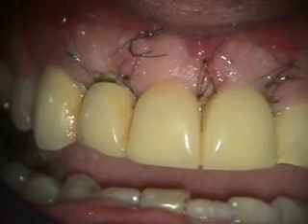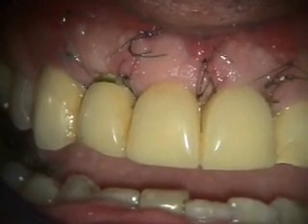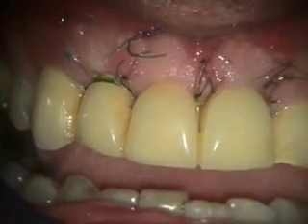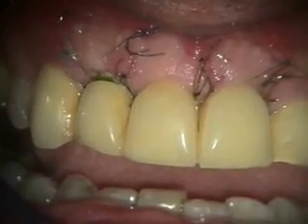This is a two-week healing of the implants placed in the seven and nine spots. You can see the sutures there. We're going to be taking those out today and we'll take a look at the x-rays next.